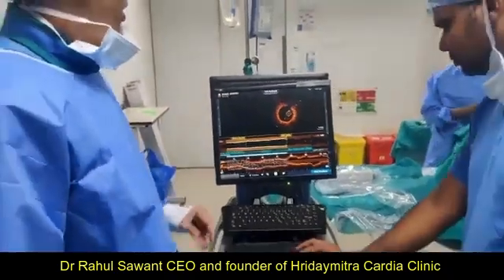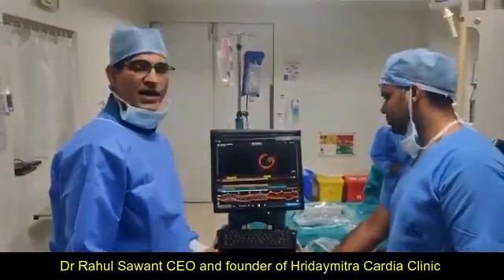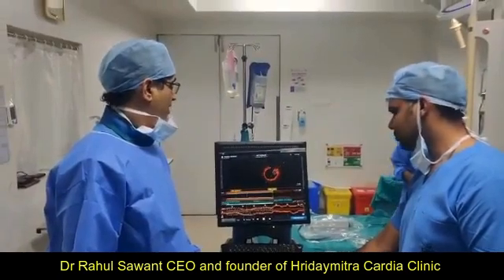If you look here now, there is no blockage. There is no clot. And the vessel is well expanded.